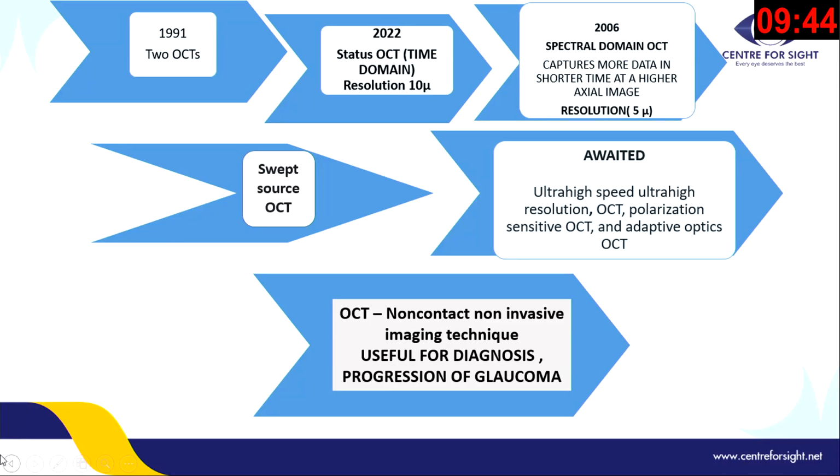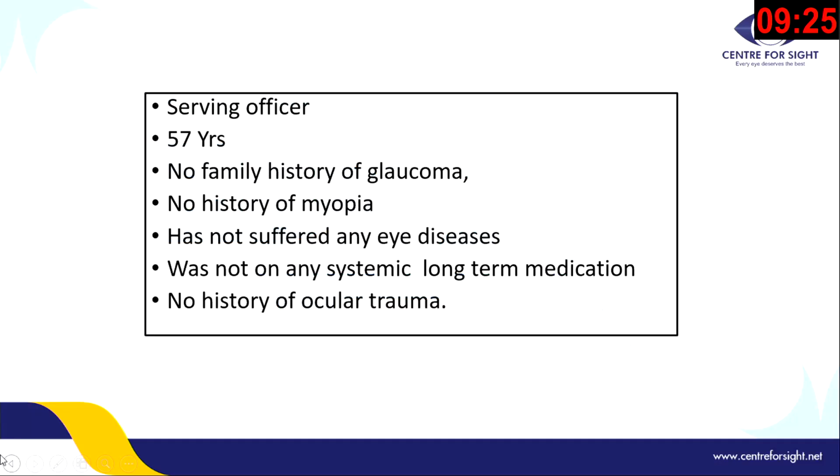So we've come a long way from 1991, where we didn't even see the first OCTs. And now we have come down to swept source OCTs. And we are awaiting a lot more into our armamentarium. It's a non-contact, non-invasive imaging technique. It's very useful for diagnosis, prognosis, progression, and many other things which I'm going to talk about.